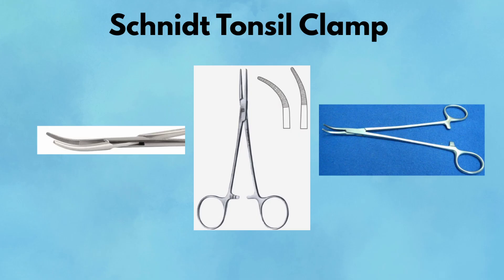Pearl: perfect for placing ties around deep vessels — thread your suture through the jaws, clamp down, and deliver with precision. Pitfall: it's easy to over-rotate or torque the clamp during dissection. Keep your wrist steady and use two hands for control when needed.